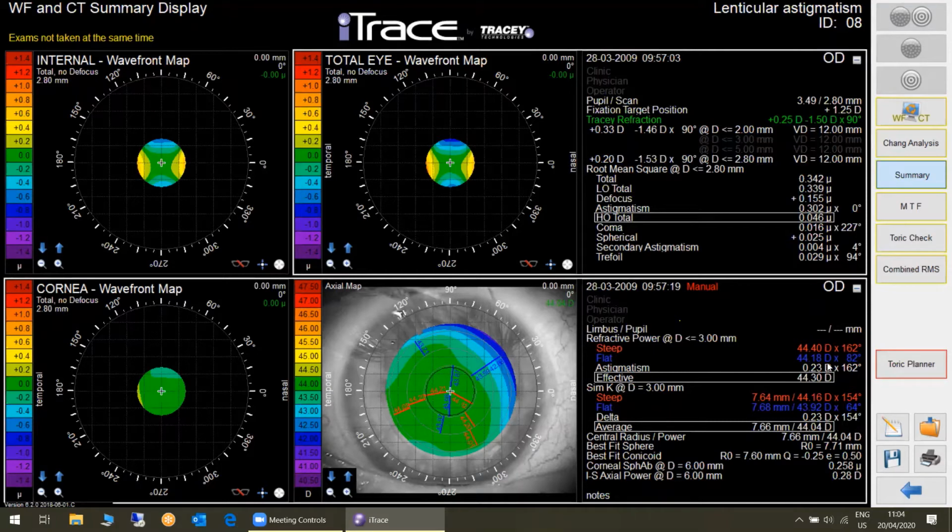This is a classic patient to be enrolled with toric low add correction IOL, in my opinion. So this means if you see that there is no astigmatism in the cornea, you are going to put preventively a toric, because it is a little bit against the rule, and we know surely that this patient at the end of surgery will have an against the rule refractive astigmatism.